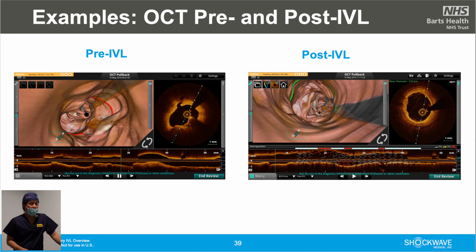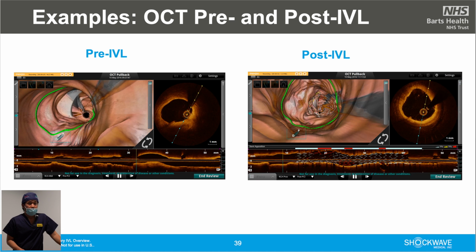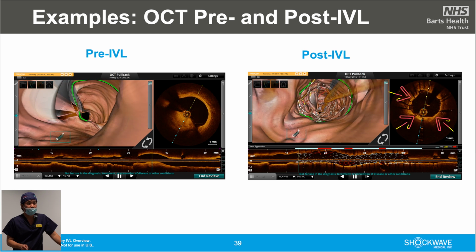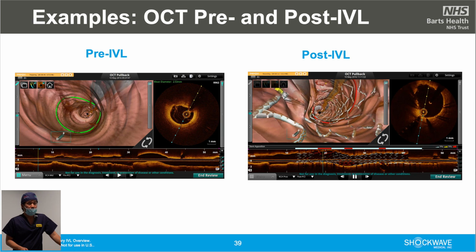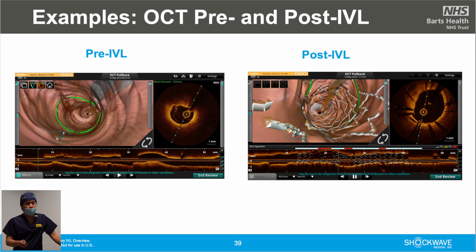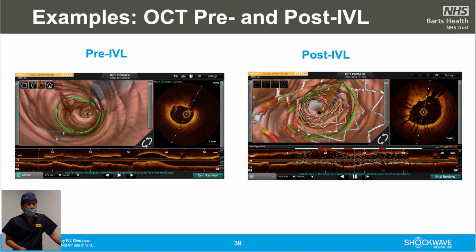And then this is after stenting. And after the Shockwave, you can really see that the stents are really well apposed to the wall, and the arteries become elastic now, so that you can expand the stent fully, which is great.